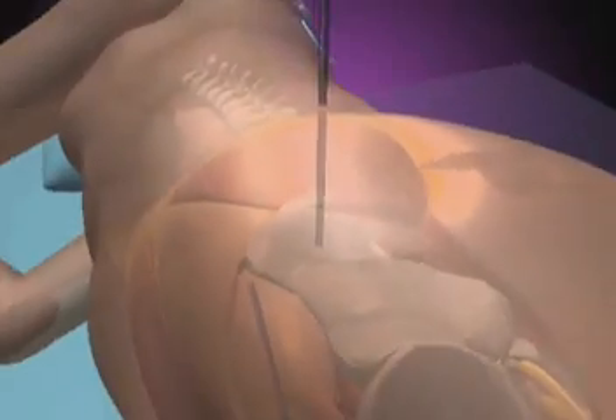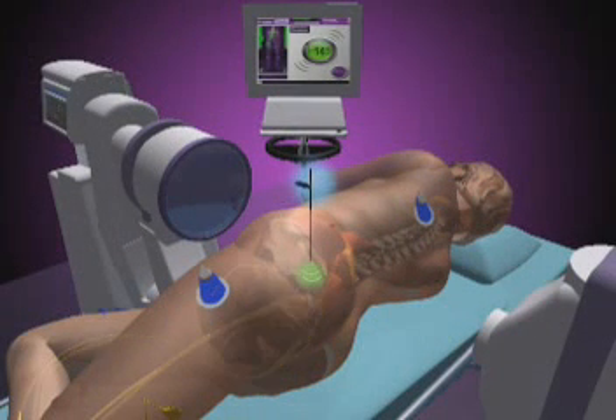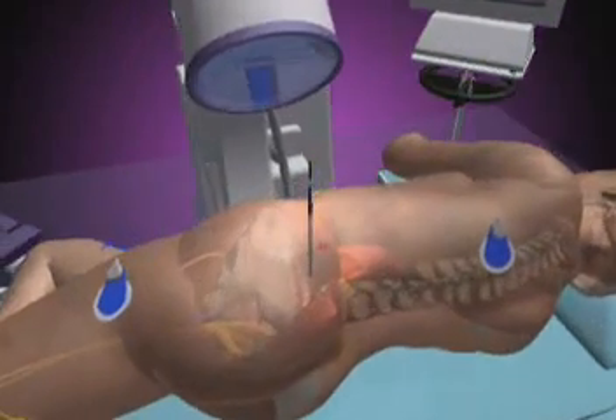As the tubes are advanced through the muscle on the side of the vertebrae, or the psoas muscle, x-rays and Neurovision nerve monitoring help to guide them to the appropriate spot on the spine and away from nearby nerves. Neurovision is a technologically advanced EMG system that assists the surgeon with safe surgical access and implant placement by monitoring nerve activity through the surgical procedure.